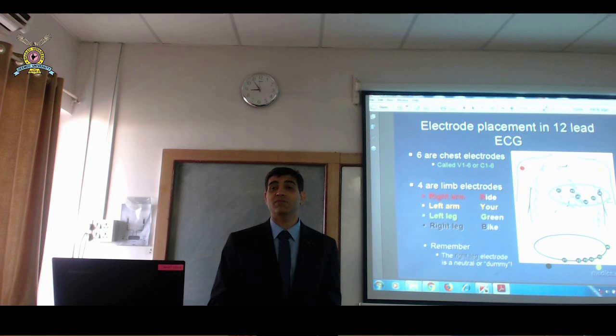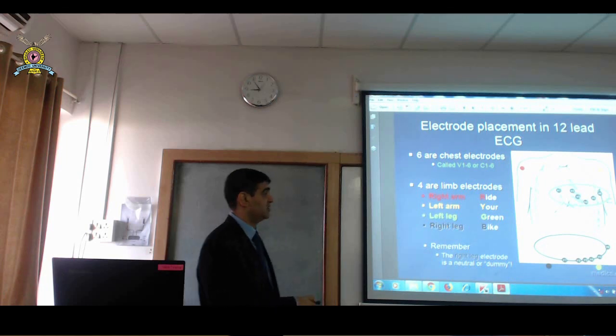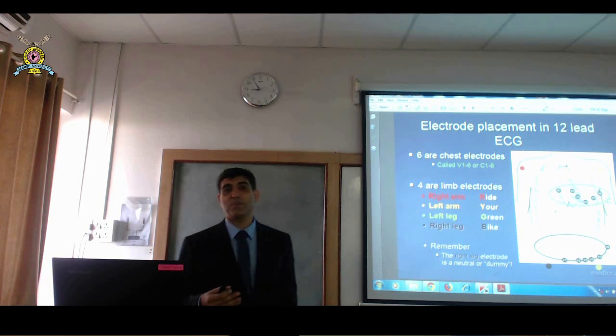Shock and raised JVP mean that patients with RV infarct are in cardiogenic shock, and they have a raised JVP in cardiac failure. That's the significance of this ECG lead. If you put the ECG lead in the right intercostal space, it's very complex.